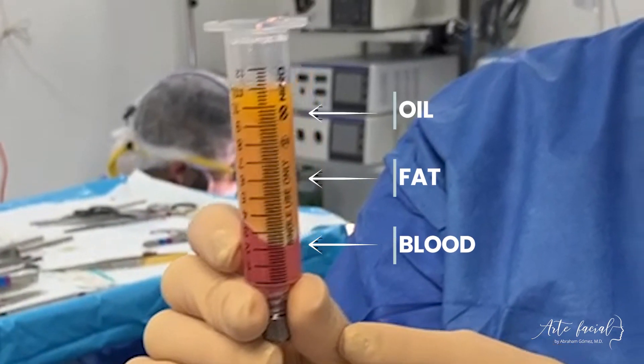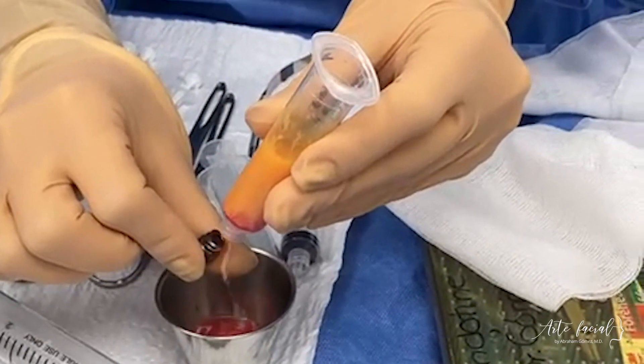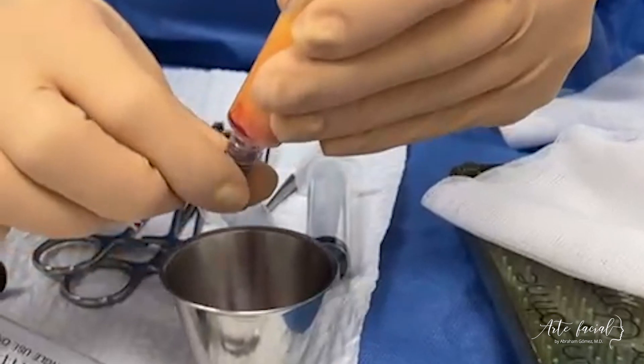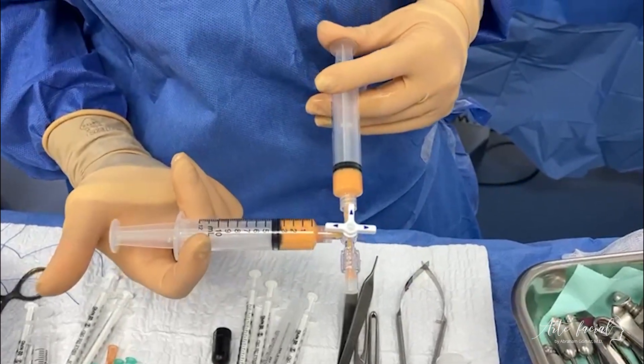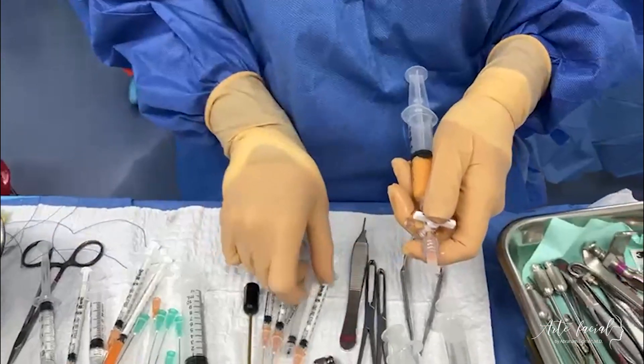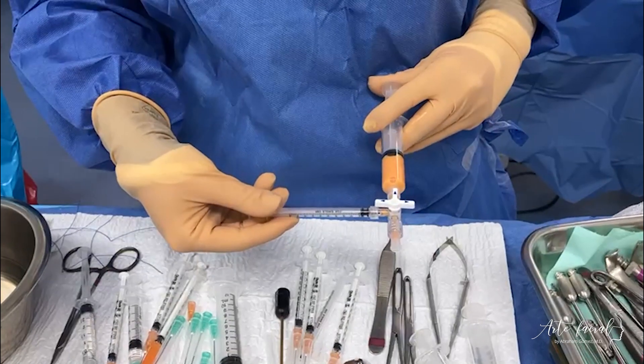Once centrifuged, the oil is poured off and the water component containing blood and anesthetic solution is discarded. The processed fat is transferred into one milliliter sterile syringes via a coupler device. The best quality fat is set aside for infiltration around the eyes.